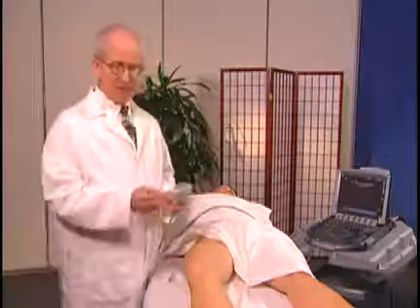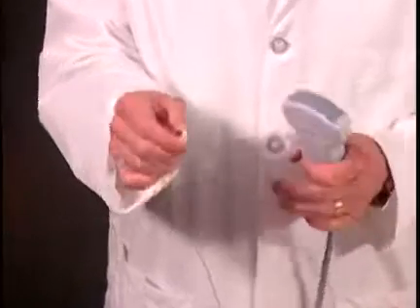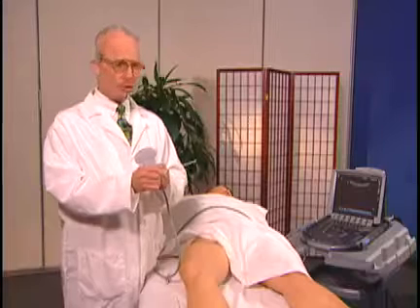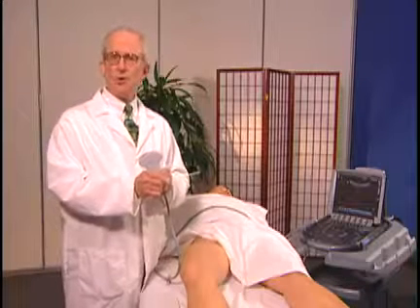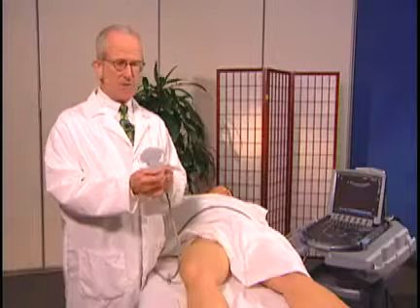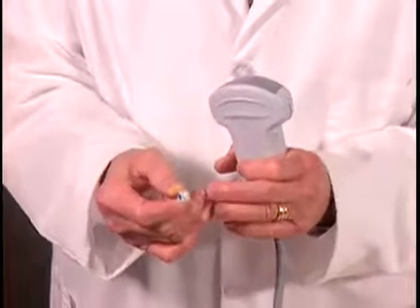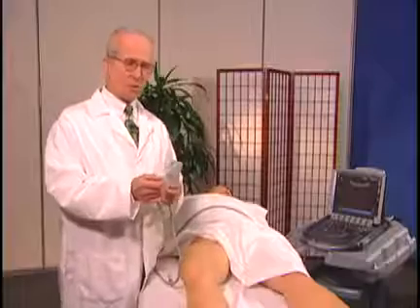The needle I've selected is an echo block needle. This is a hundred-millimeter, approximately four-inch needle. You can also use a spinal needle, but in an individual who's large, sometimes you need a special needle like this, which has marks on it that reflect the ultrasound beam and make it much more visible.